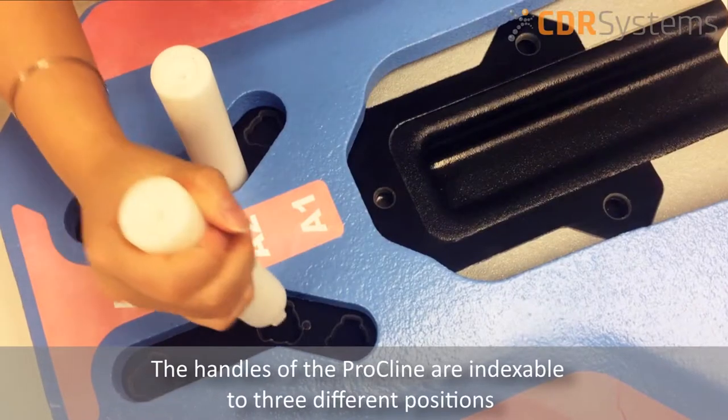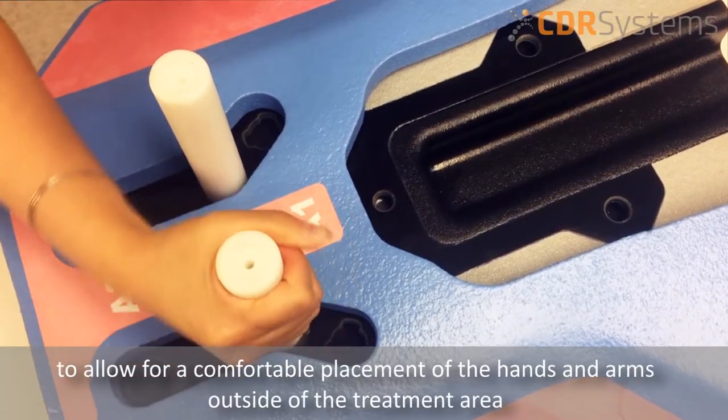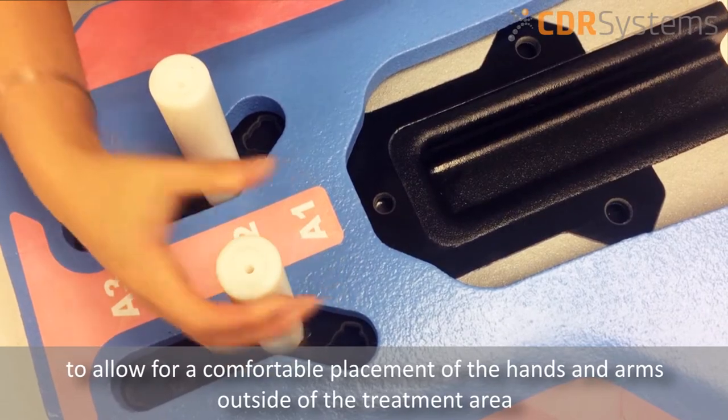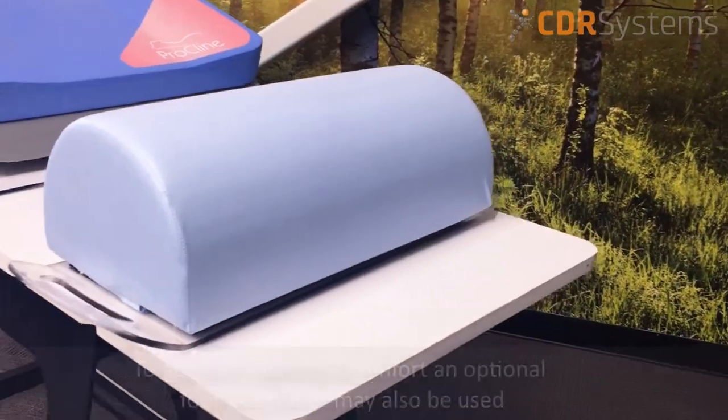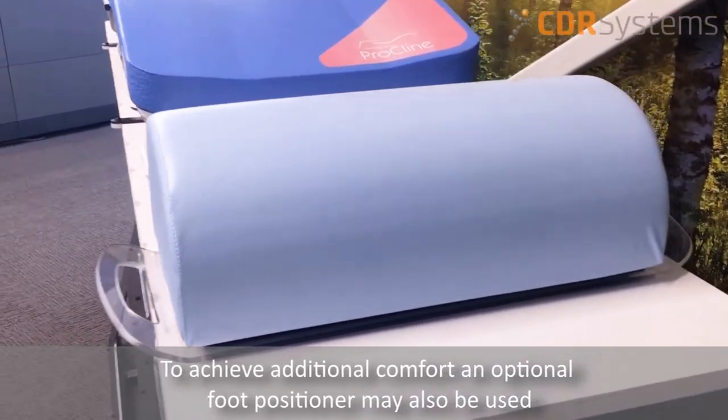The handles of the Procline are indexable to three different positions to allow for a comfortable placement of the hands and arms outside of the treatment area. To achieve additional comfort, an optional foot positioner may also be used.